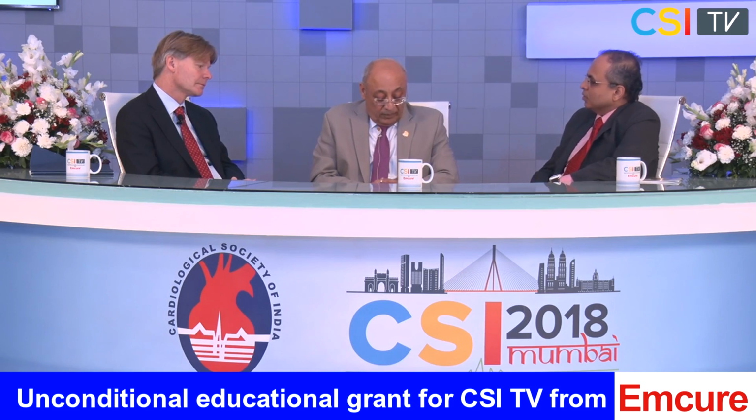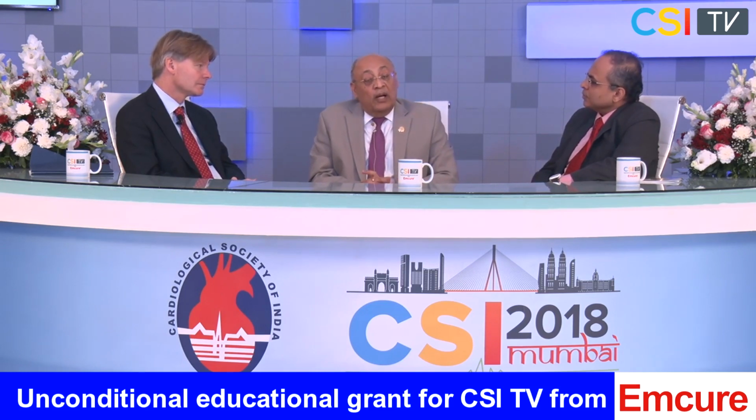And Dr. Narula, with your nuclear imaging background, can you shed some light on what the advances in nuclear imaging for the myocardium are, which are going to change the future or the way we manage patients? So, nuclear imaging, as you very well know, specifically with single photon imaging, has the most important historical role to play in patient management, specifically for the assessment of ischemia. It is time-tested technology, tested on the largest number of patients, and gives us value.